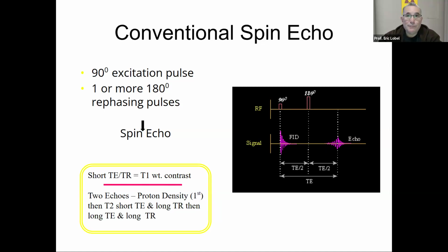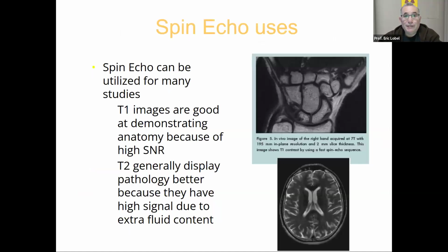Better than the original vanilla spin echo sequence, but still, and you're going to see it is much faster, but when we get to the steady state, it just takes on, I don't know, fast spin echo is like a race car compared to a horse, but gradients are like that sports car compared to a rocket ship in space going 20,000 miles an hour.